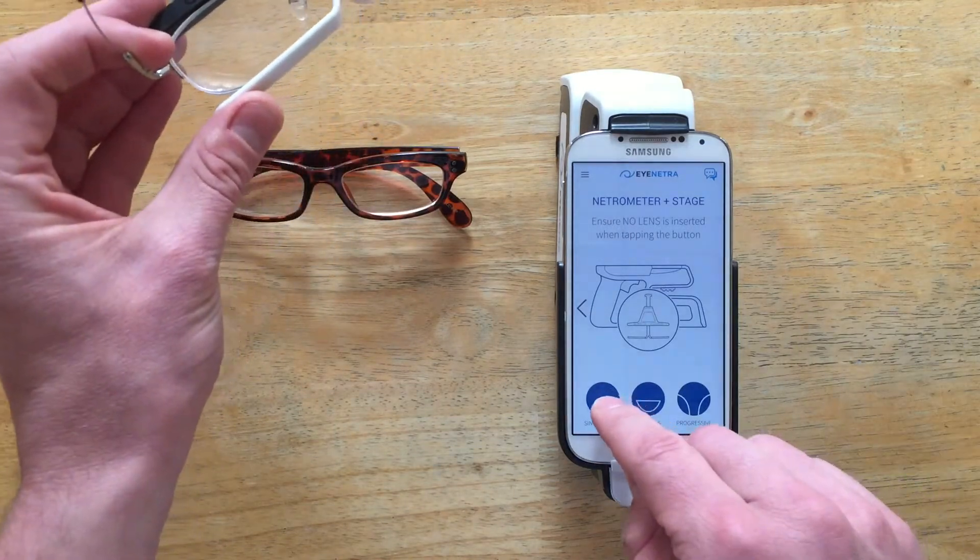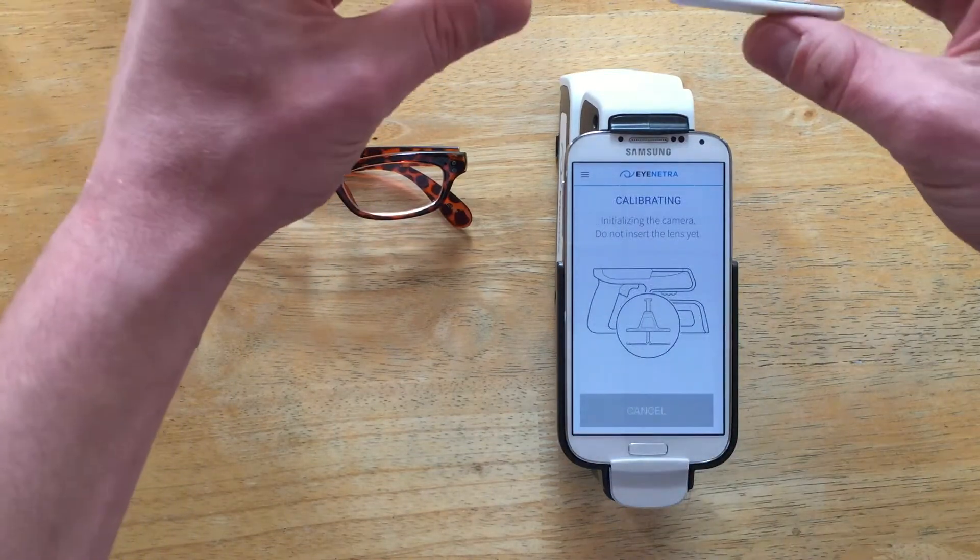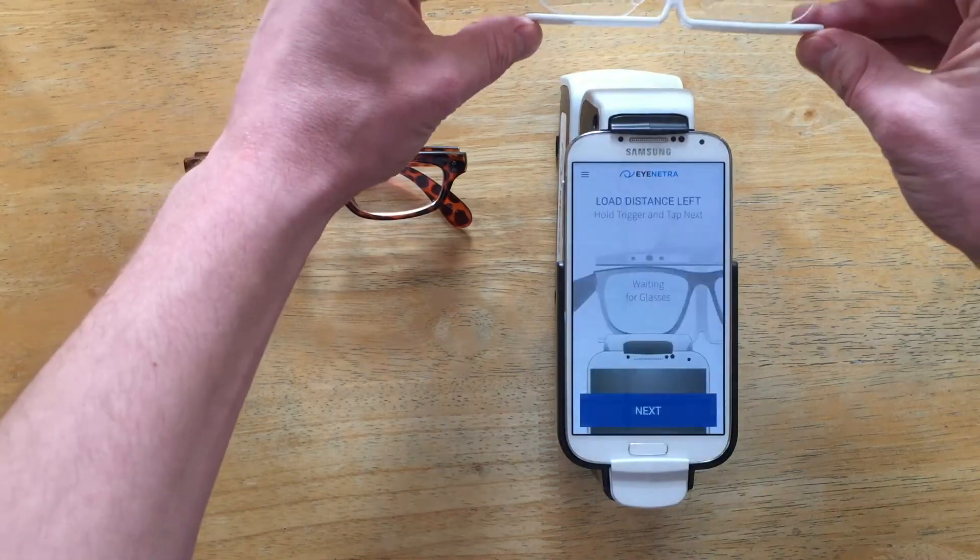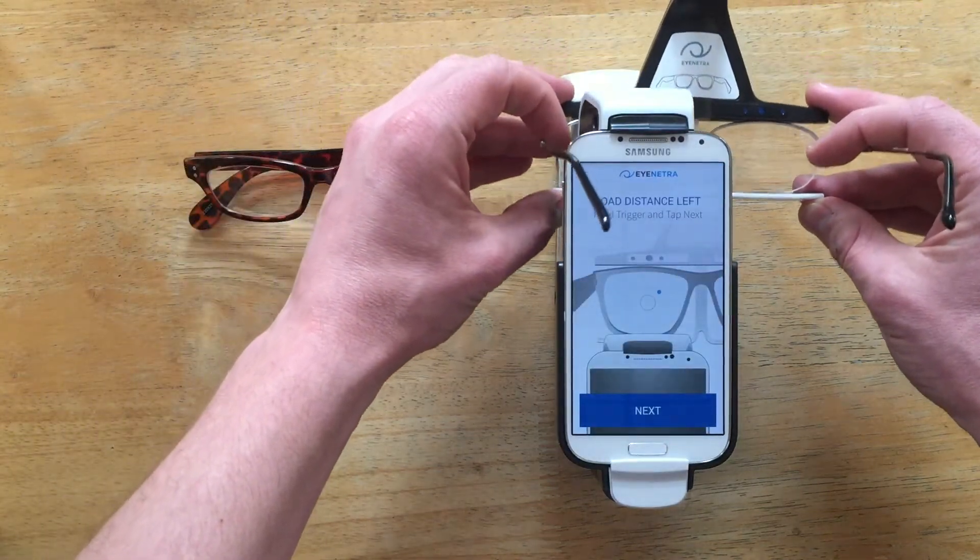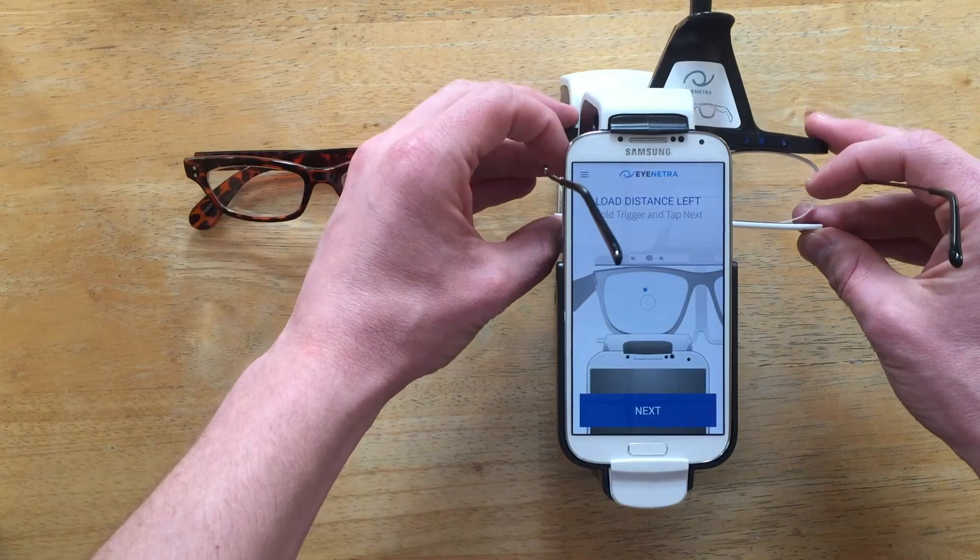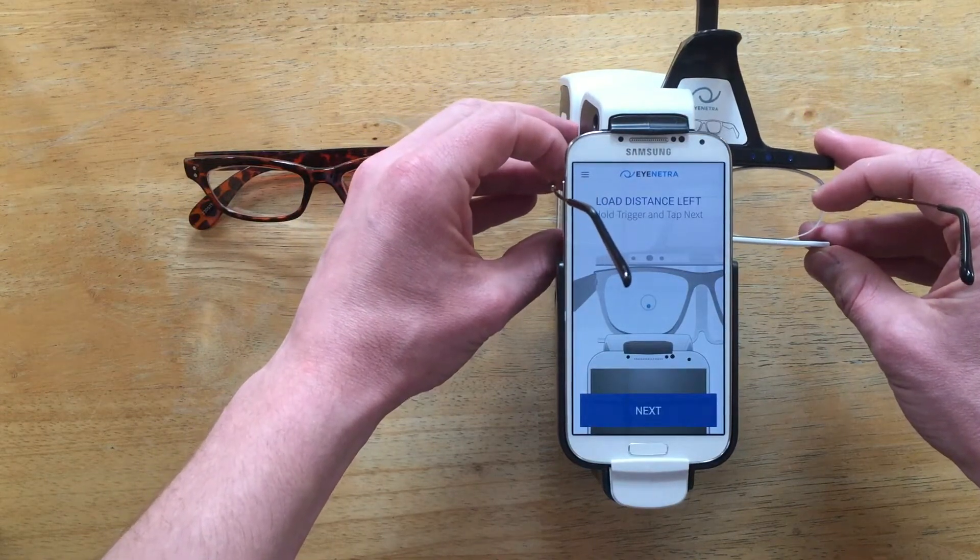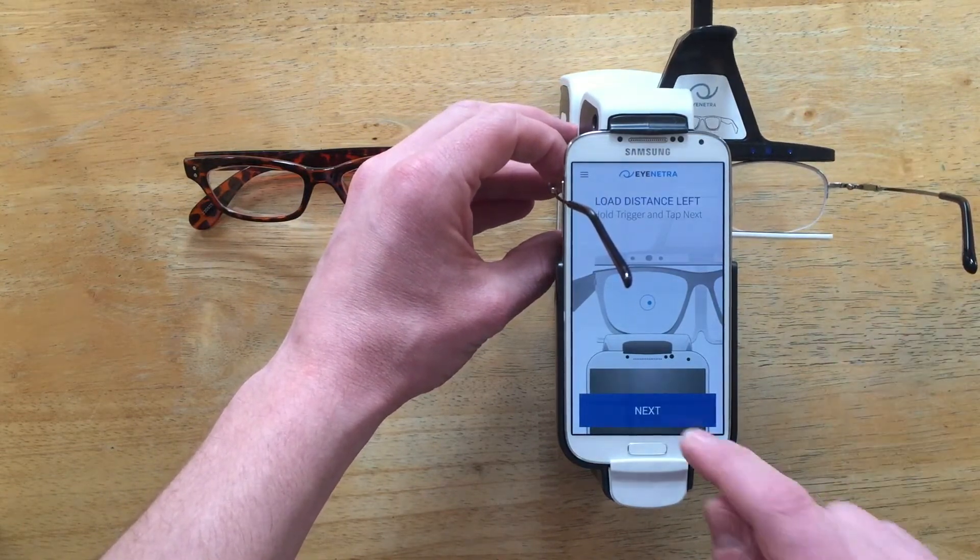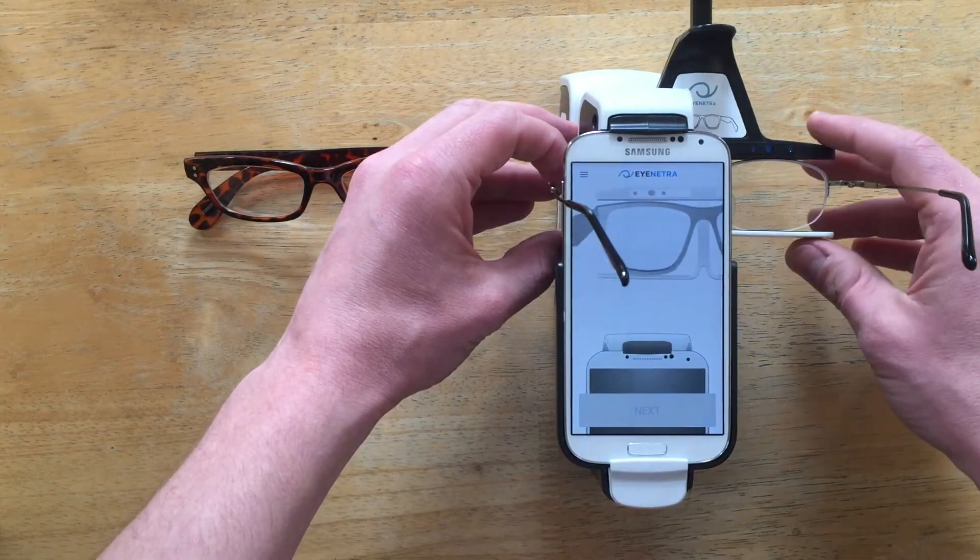So let's take a look. I'm just going to operate like I normally would. Simply insert the stage into the Netrometer, align the dot in the circle as normal, and tap Next.